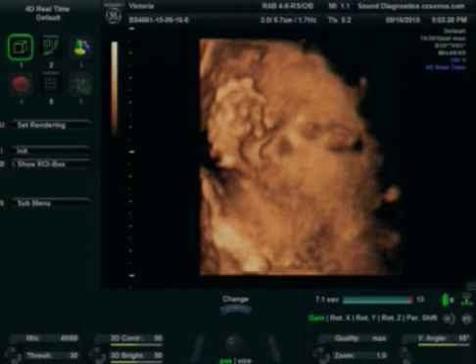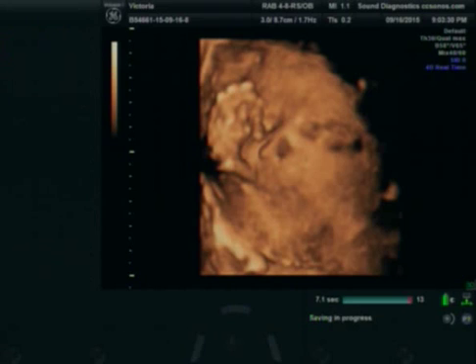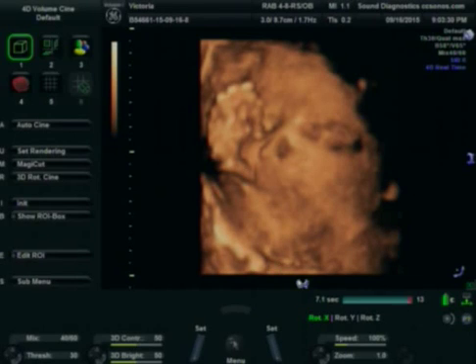Looks like the thumb working into the mouth. See that? Yeah. Eye, nose, mouth. There's the thumb, and here are the fingers. And the nose looks totally smushed. Little Victoria. Alright. Stubborn.